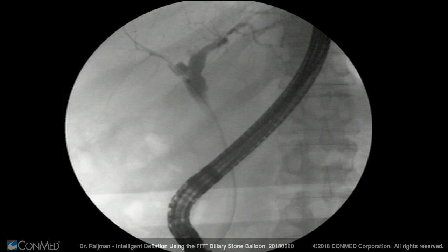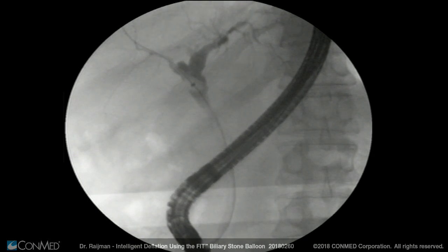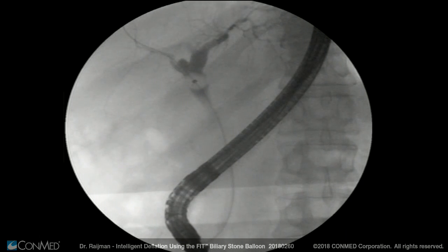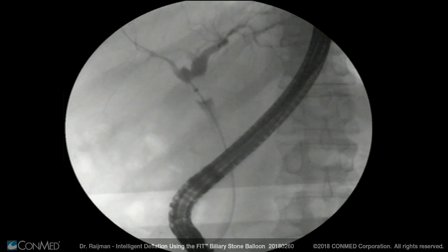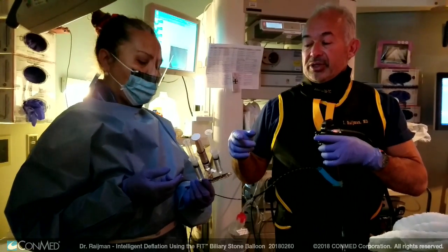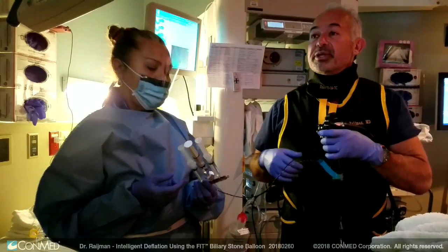I engage the balloon at the level of the bile duct. The reason I want to do that is to make sure that absolutely no contrast travels proximally other than what we are intentionally injecting. So I inject proximally — not even one cc — and we have everything we need to now evaluate the proximal biliary system.